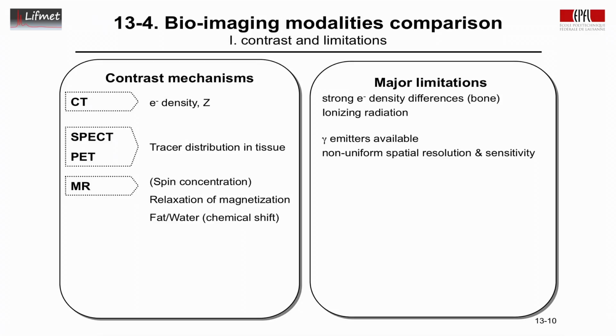We have also seen that with spectroscopy one can distinguish the chemical environment of the proton nucleus, of the hydrogen nucleus in the tissue, and for MRI the major application here is to distinguish whether the signal that one observes is due to fat or water based on the chemical shift. We have also, this week, discussed the effect of motion and diffusion.